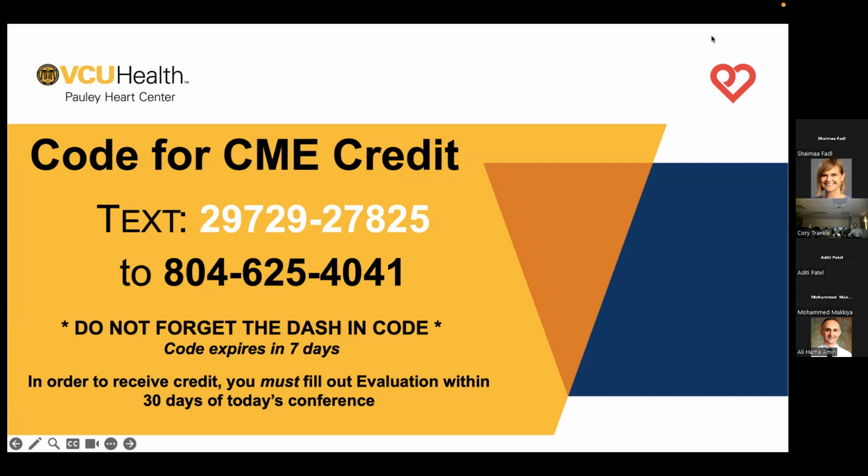But regarding the differences between females, whether it's really a value for female carriers, I struggle to even see some of the literature highlighting that role of cardiac MRI in inherited cardiomyopathies specifically. But if ECV and T1 values play an important role in cardiomyopathy in general between females and males, I think there are some differences. I just don't have a paper on top of my head.